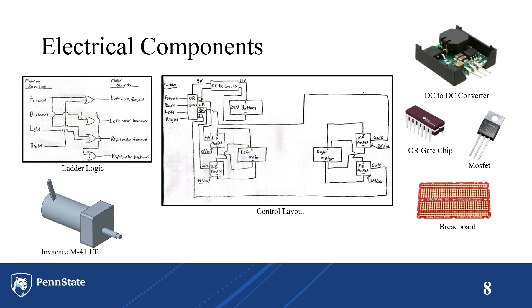For the electrical components, instead of using a PLC controller, we are using an analog system. The ladder logic for the input and output buttons for the motors is shown on the left. The control layout in the middle features the DC converter, an OR gate chip, four MOSFETs, and a breadboard. The bottom left shows the motor we're going to use, the Invacare M41 LT.